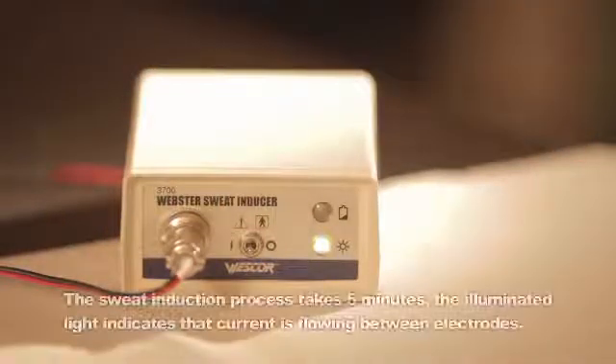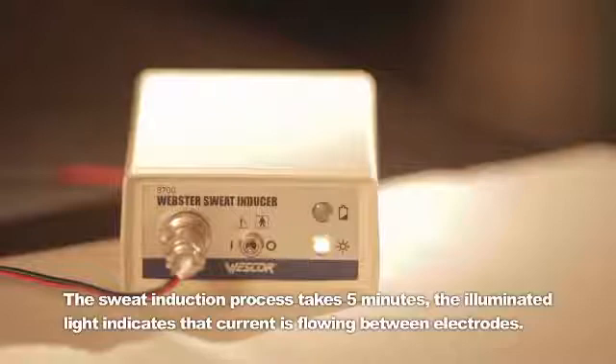Press the control switch to the run position and hold momentarily until you hear a short beep. The sweat induction process takes five minutes. The illuminated light indicates that the current is flowing between the electrodes. During the sweat induction process, prepare the macro duct sweat collector.